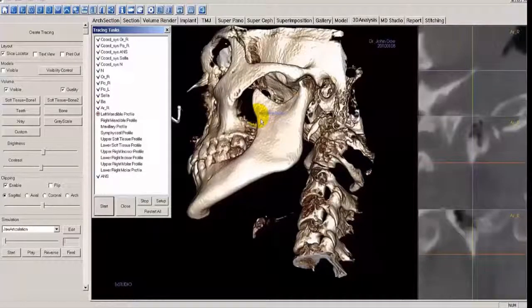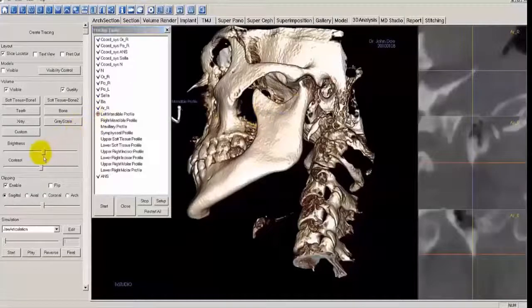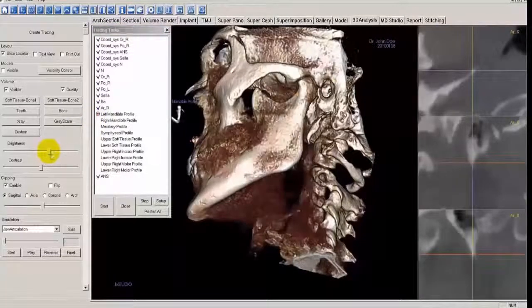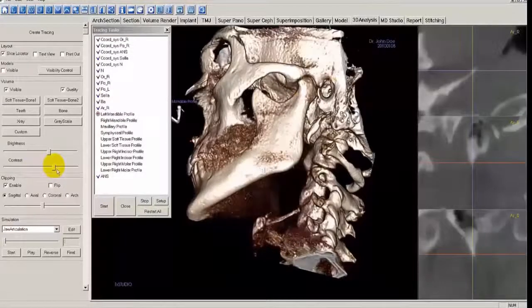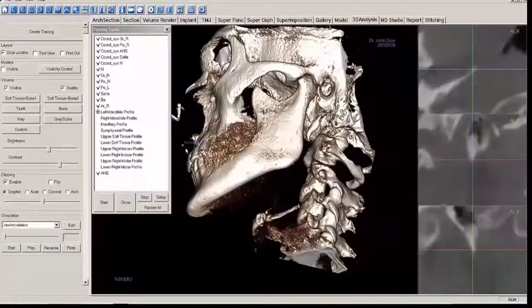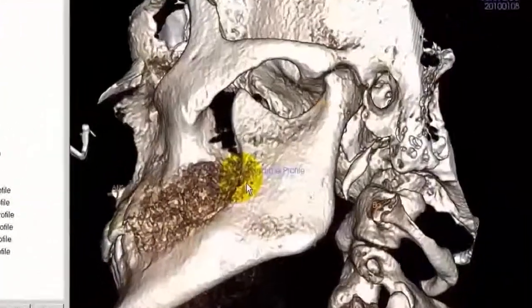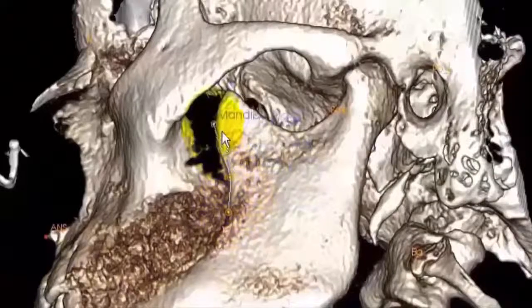As you begin drawing the condylar profile, you may find it difficult to see the borders. The condyle has low bone density and is highly vascularized. To help viewing the condyle, you may need to adjust the brightness and contrast. When you get to the condyle, use the three-point method for greater accuracy: pick the most posterior point, the most anterior point, and the most superior point of the condyle. Let's go ahead and trace the coronoid process.